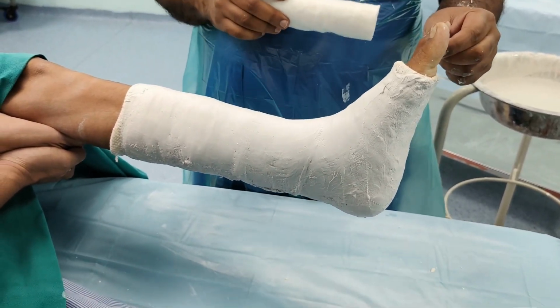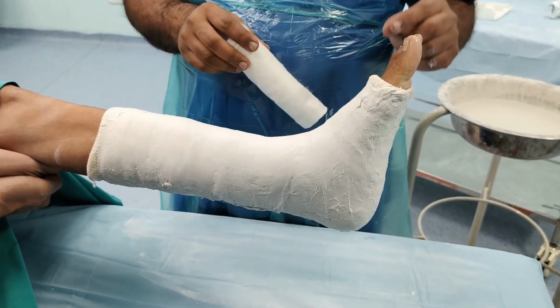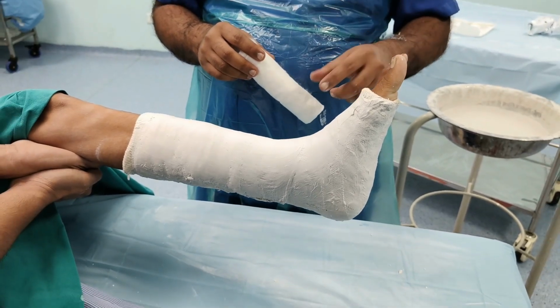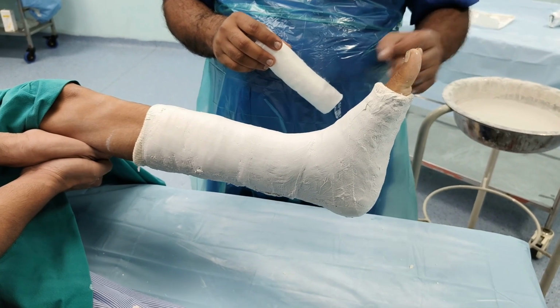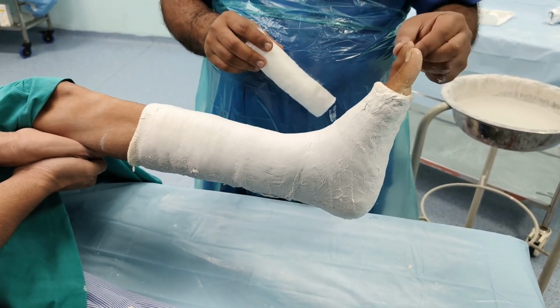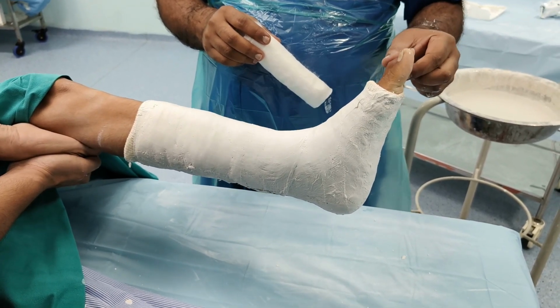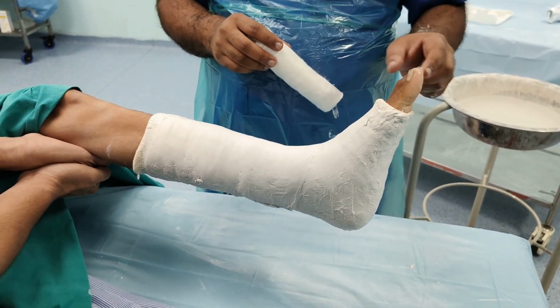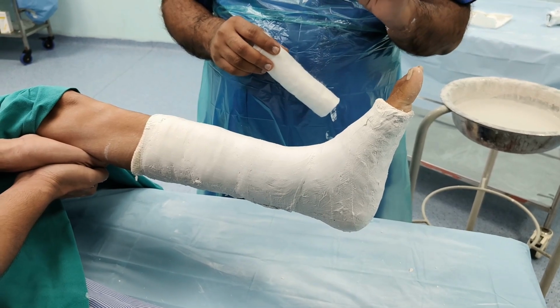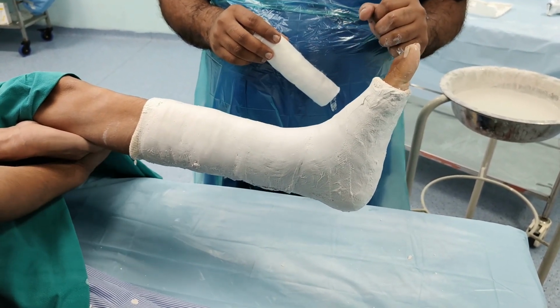Patient has to do active movements of the toe, and if the patient thinks or feels that the plaster is tight, means he feels a constricting pain around the limb, and there is some swelling in the toes and or some color changes in the toes, then in that particular case he has to immediately rush to the hospital and the plaster has to be removed. Otherwise you can land up in disaster complications.